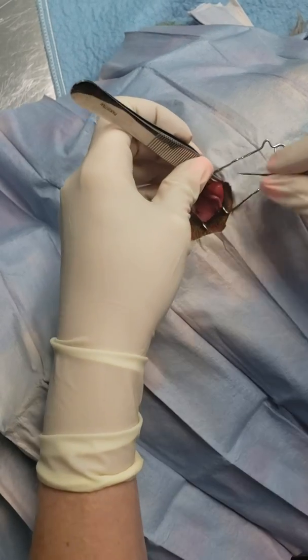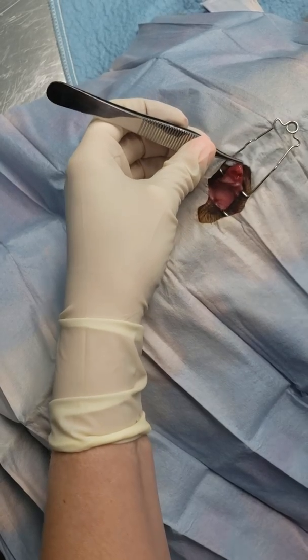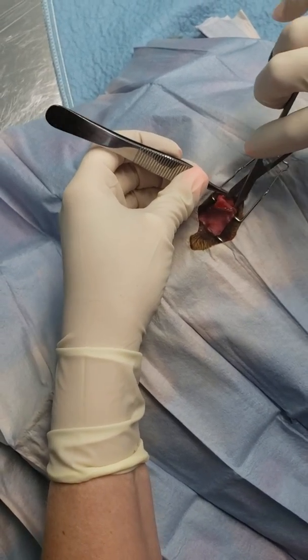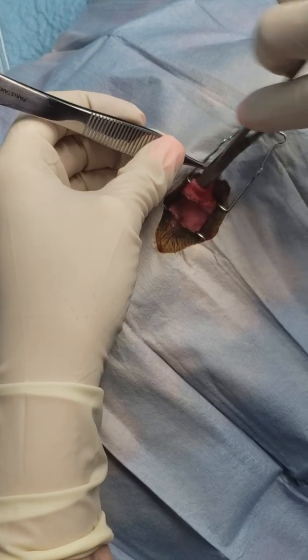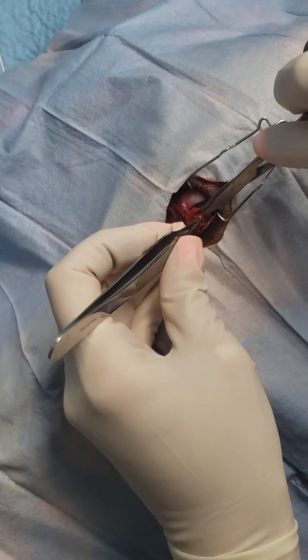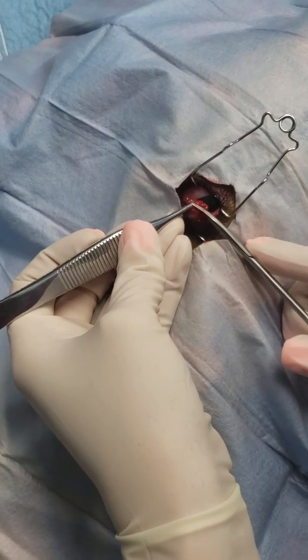And then we do that on the other side as well, again bluntly dissecting so that you can get your pocket. I'm just going to trim a little bit of that cartilage that's poking up.